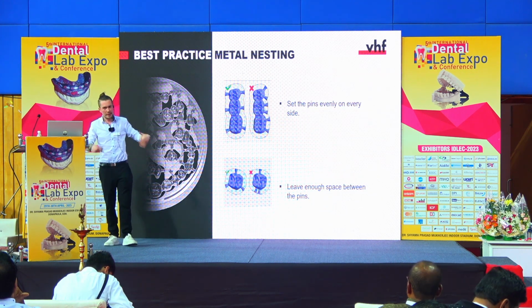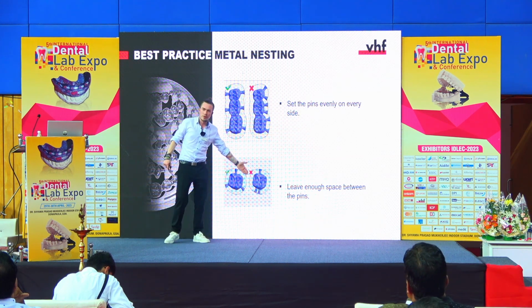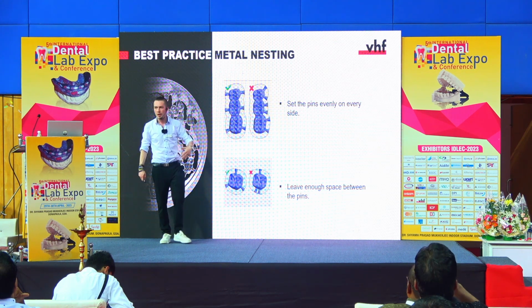Then of course here, this is the same as in the design step. This is not bringing any benefit to the stability, it's just making it difficult for the machine to mill and has the risk that the tool gets stuck.